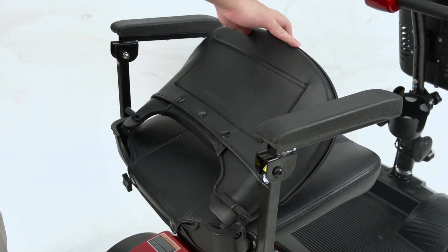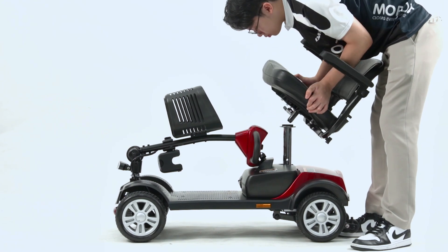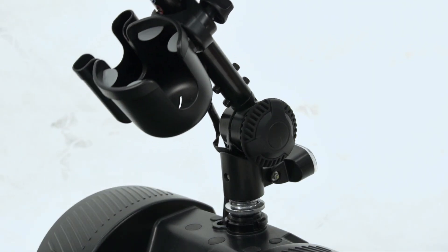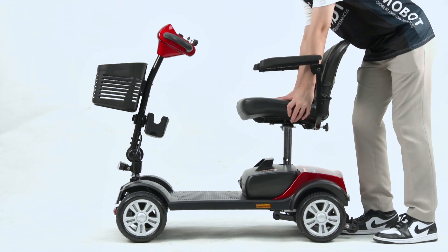Unfolding: First, put the backrest of the seat back up and remove the seat from the body of the device. Carefully bring the stem back upright and tighten the knob. Lastly, attach the seat back up onto the body of the device.